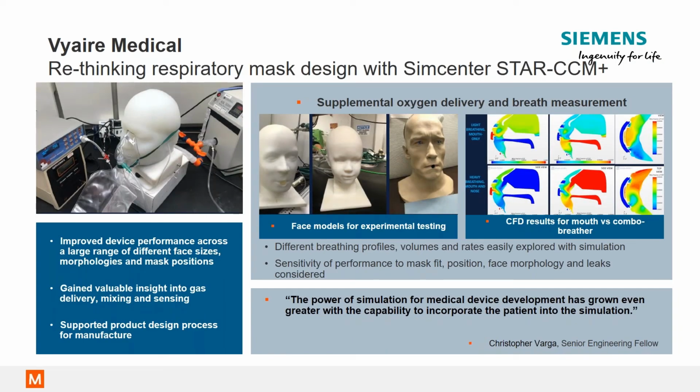This example was done with Vyaire Medical again. So in this case, they've been looking at simulating respiratory masks with 2 cycles, one where the patient is inhaling, and the second one where the patient is exhaling. So you can see those on the top right corner. The challenge with respiratory masks is that you want to bring as much oxygen to the patient as possible whilst exiting the carbon dioxide in the meantime to avoid rebreathing CO2.